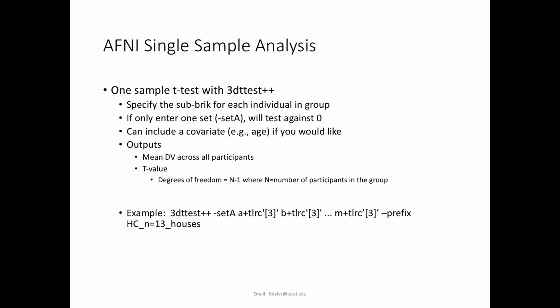20,000 times, you mean because it's doing it per voxel? Yep. Next week, Alan's going to talk about clustering and thresholding, and obviously that's a big deal. That's one of the biggest differences between doing this on 8 cognitive tests versus 20,000 voxels: you have a huge chance of false positives. So we have to figure out ways of making sure that the activations that we see are reliable.